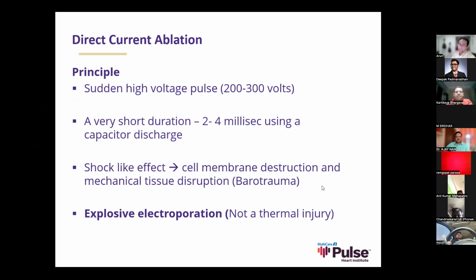And you will see that similar concepts are applied in the most modern technologies, like in PFA, where you have electroporation, but that is a more controlled electroporation. And if we have time, we'll talk very little about it. Most of the focus is going to be on RF.